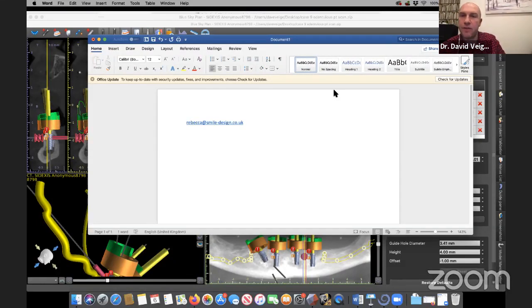Dennis Lee, just to confirm, the 2 scans needed for the dual scan technique is the CBCT of the patient with the prosthesis in, placed with the glass radiographic markers, and an STL of the prosthesis itself. No. So the dual scan technique is, the patient will have the denture with the radiographic markers in their mouth. You'll put them in the scanner. First scan, CT scan. Then you'll take the denture itself and put it in the CT scanner as well. Scan the denture. Now you have 2 sets of DICOM data.